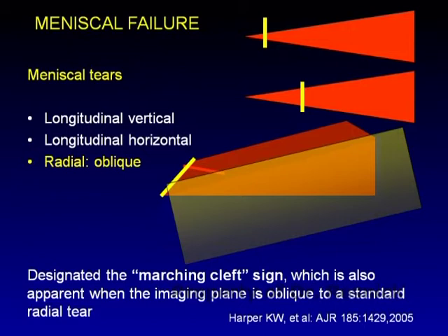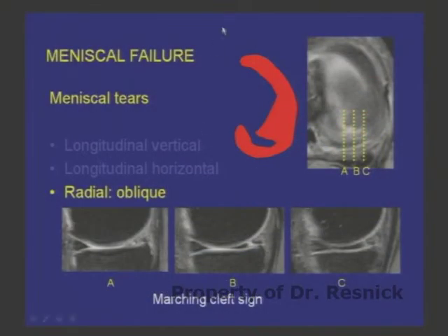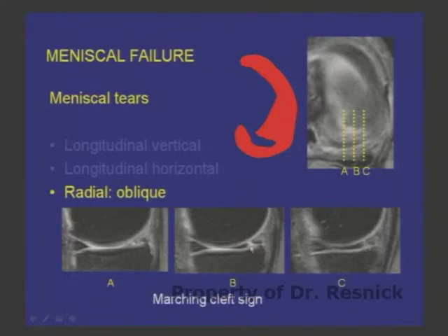Radial tears often become oblique — curving rather than straight — forming a parrot beak tear. A displaced radial tear is a parrot beak tear. On sequential sagittal images, the cleft marches either toward or away from the inner margin — the marching cleft sign. This indicates a radial oblique tear. If you see a vertical-appearing line in the inner half of the meniscus, you are dealing with a radial tear, not a longitudinal vertical tear — and the prognosis is very different.